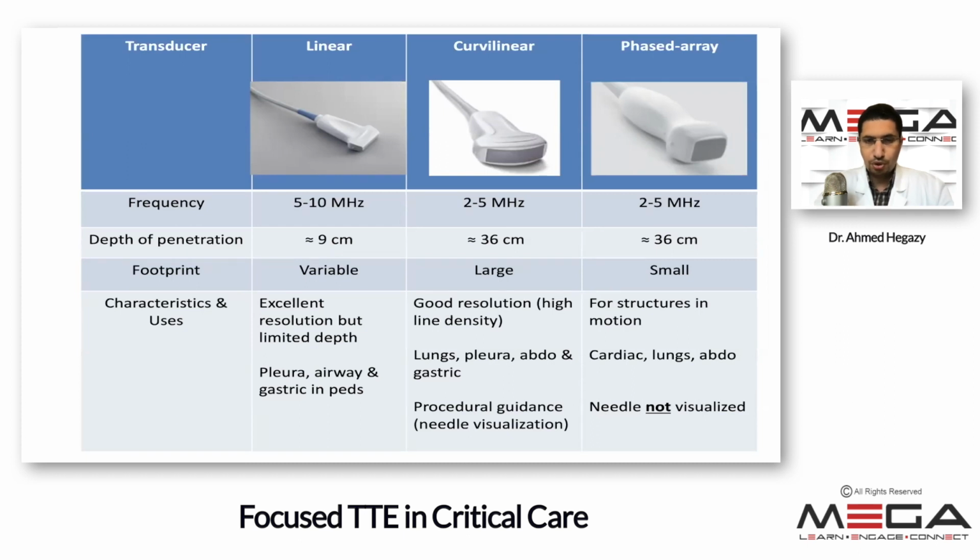So we use linear probes for line placements because they give us the depth that we need, and the resolution shows us the actual needle and the needle tip. It can also be used for pleural interrogation, airway exam, and gastric exam in peds.